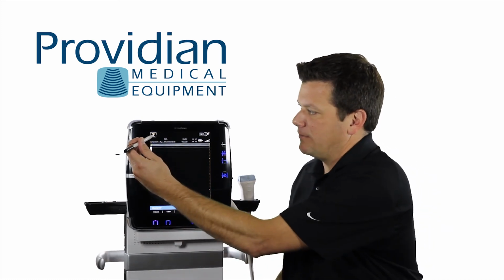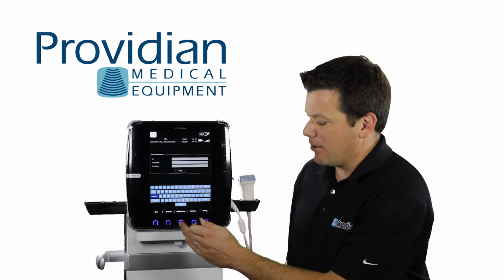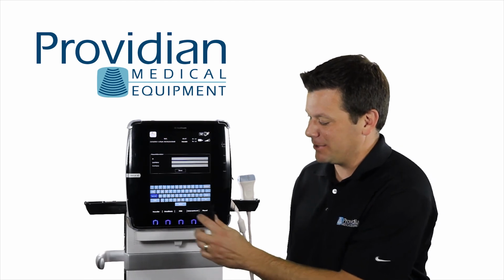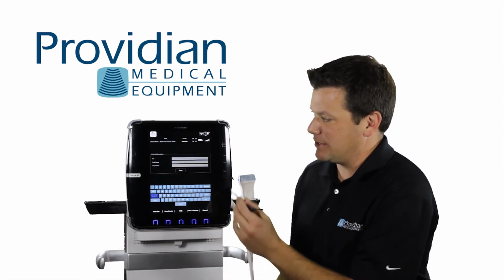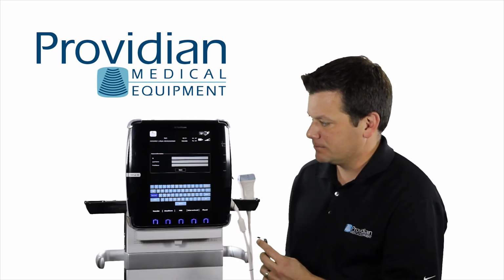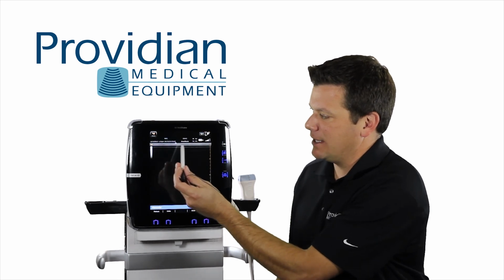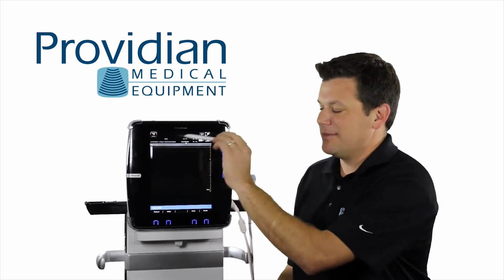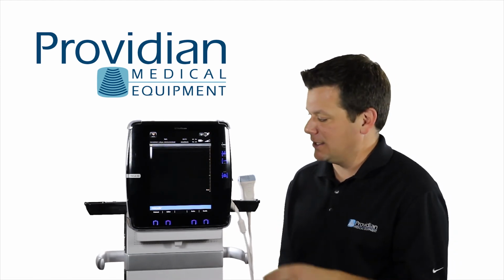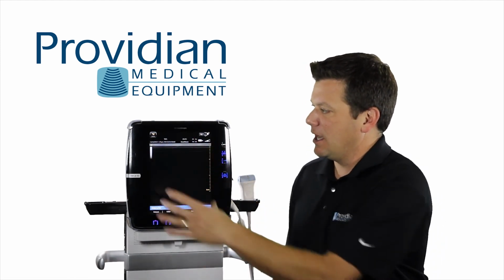Now let's say we want a different vascular in here. I'm going to go ahead and hit the preset again. Now I select application. Yes, I understand it's a little confusing. We're going to go ahead and hit application. Now it gives me those same settings within this vascular package. I'm going to go ahead and we'll choose anesthesia. And here we go. Now we have the patient information, the patient ID, and it's set in anesthesia setting. And these settings are set to be optimized for the type of exam you're going to be doing. For anesthesia, it assumes you're going to be doing a shallow and high resolution with a focus up in the near field.